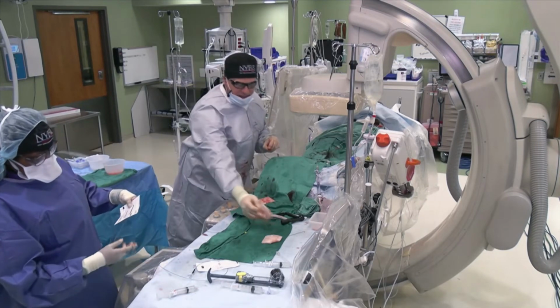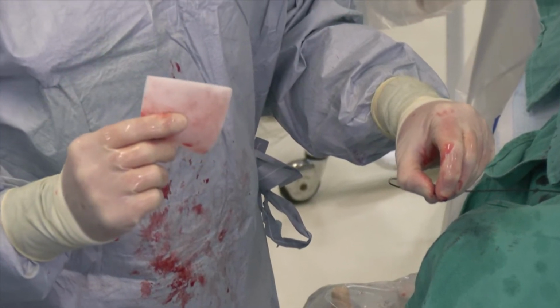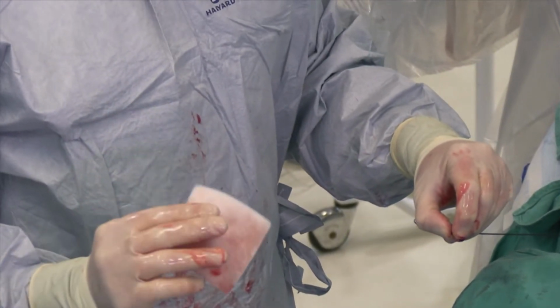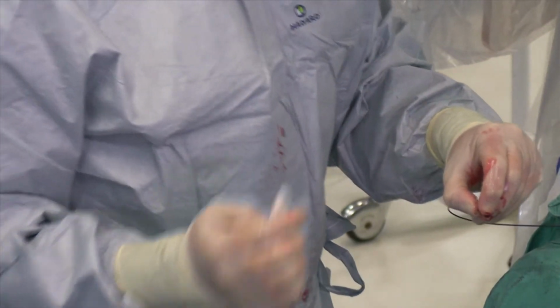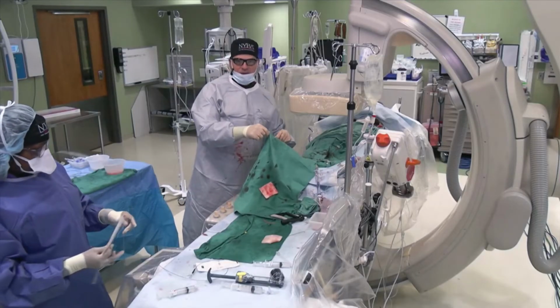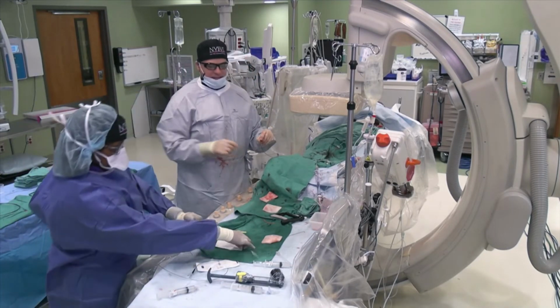The other things I've got on my deck, you see these, instead of using gauze, Wayne, can you mag up on this? These are swipers. Instead of using gauze, the gauze leaves debris on your devices, your wires in particular, just like these green towels, right? They leave debris on there and it goes in there. So I usually like to use these.